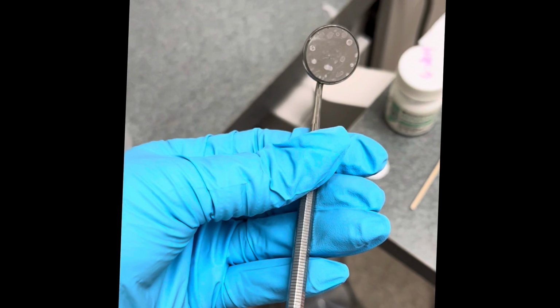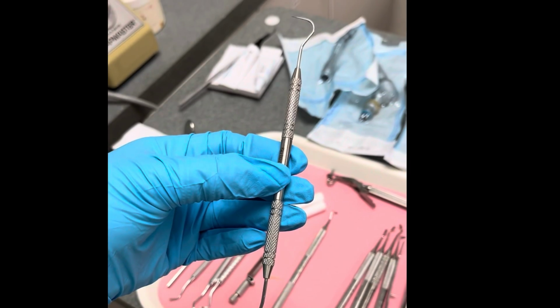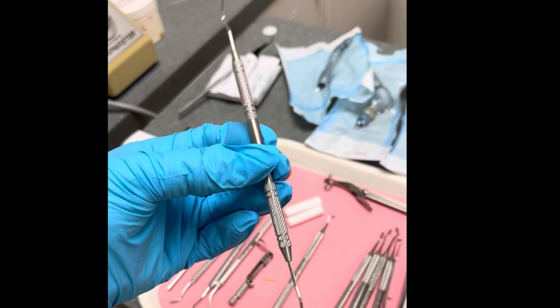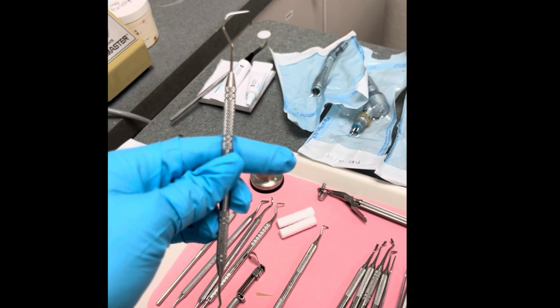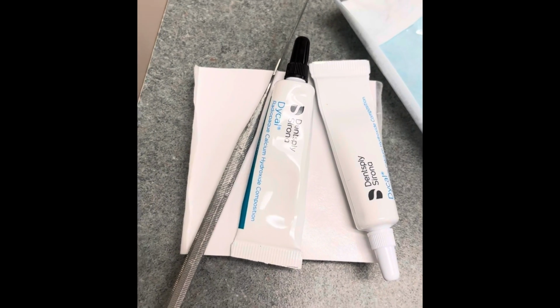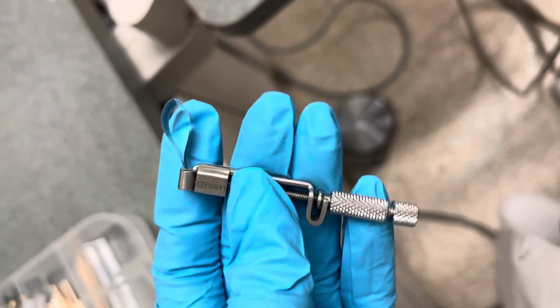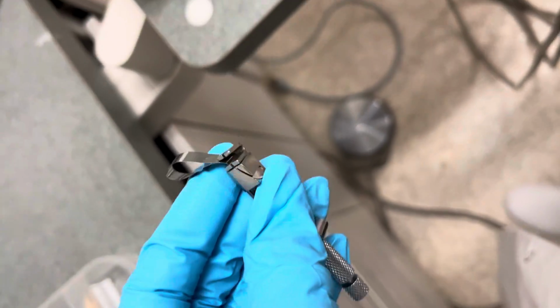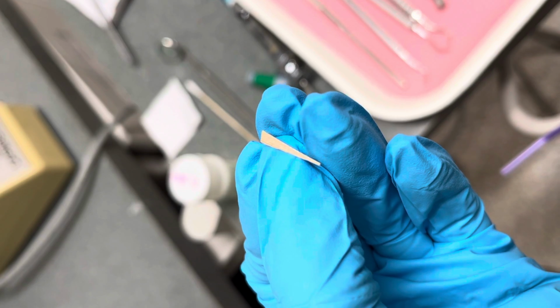You're going to first pass the mirror and explorer to help the dentist see any imperfections in the mouth before starting the procedure. You will need to have the Dycal base liner ready for the doctor for direct and indirect pulp capping. You will then use a Tofflemire for class 2 restorations. Once the Tofflemire is in, you will need a wedge to hold.